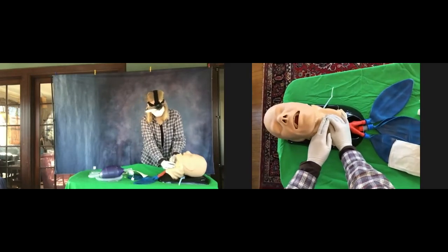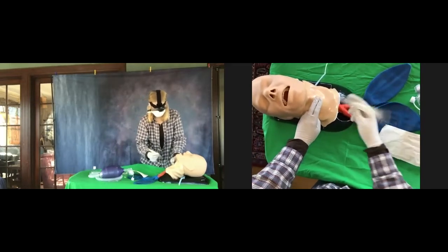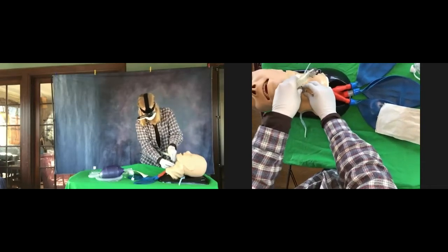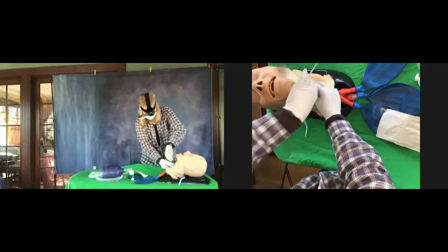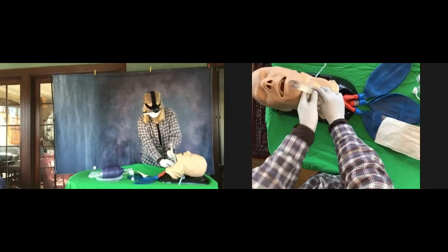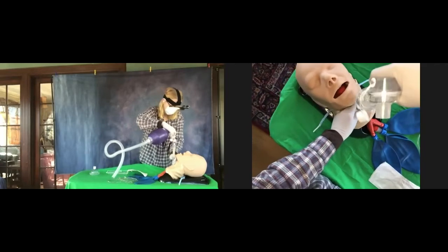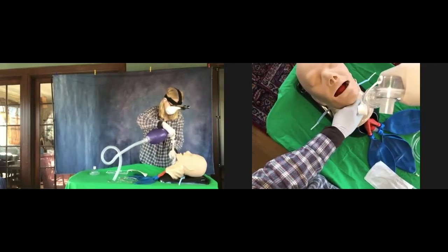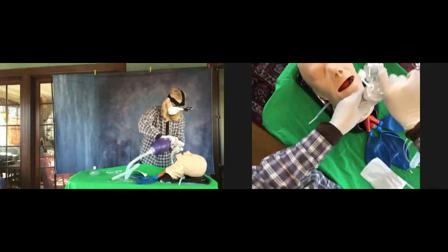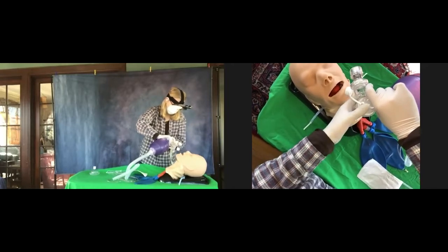Now take the airway adapter — that corrugated tube — and attach it to the airway, big end down. Push it on nice and snug. Hold on tight there. Use your left hand to hold it tight. With your right hand, pick up the bag valve mask and hook that up to the other end — use the other connector. Hold that all in place and gently squeeze the bag valve mask with your right hand.